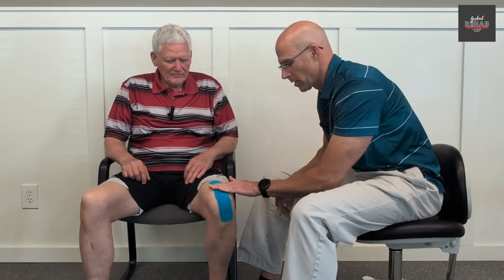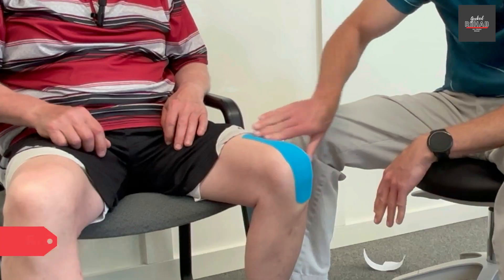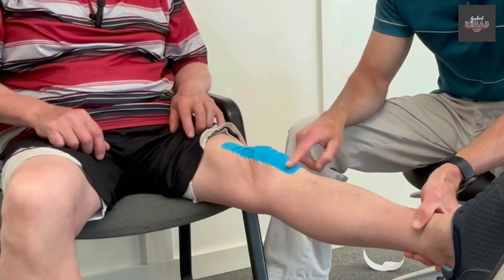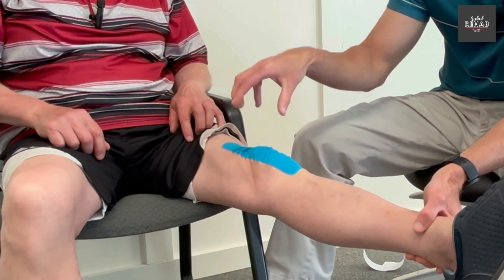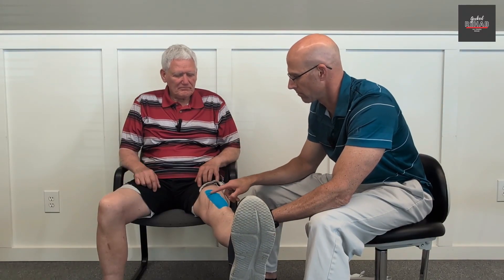You want to rub it on to get the adhesive activated. All right Doug, go ahead and straighten your leg up. That's what we're looking for — all those wrinkles, all those convolutions, are pulling the skin up and pulling the tissues below the skin up, decompressing everything underneath the tape. That's what we want. The more wrinkles, the better.